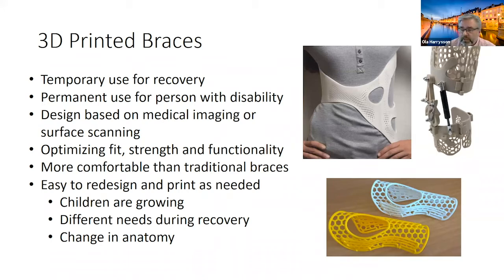And also, of course, you might have a change in the anatomy as you're going through these treatments. So this is a case when you're treating scoliosis. These 3D printed braces need to change as the curvature of the spine is being corrected.